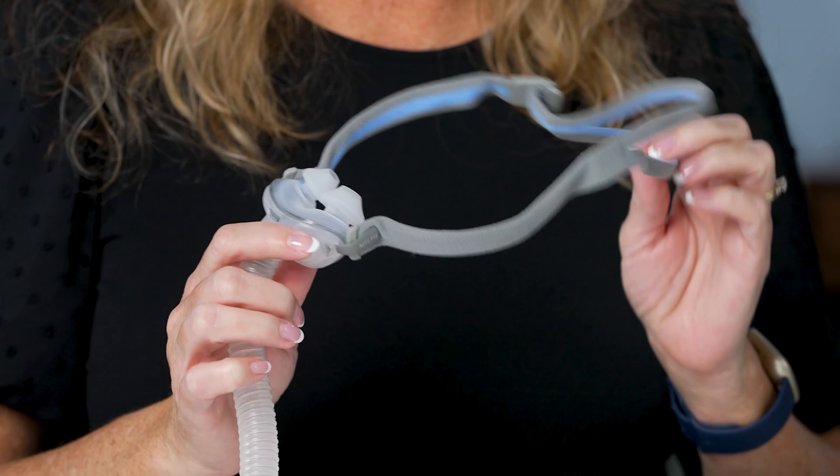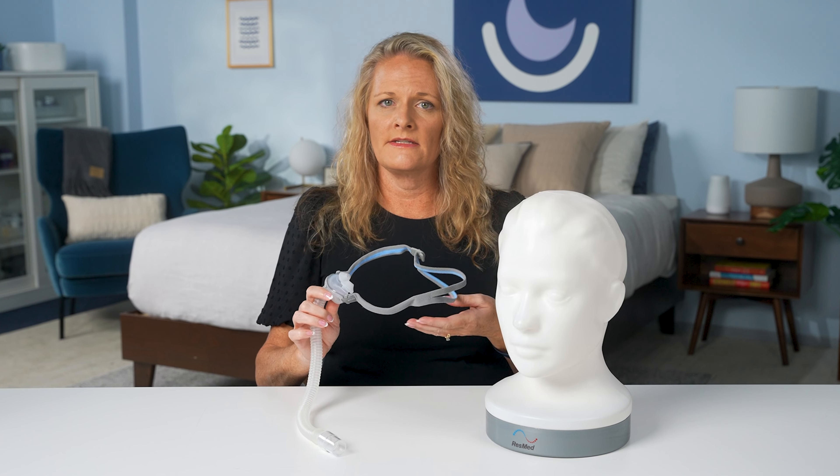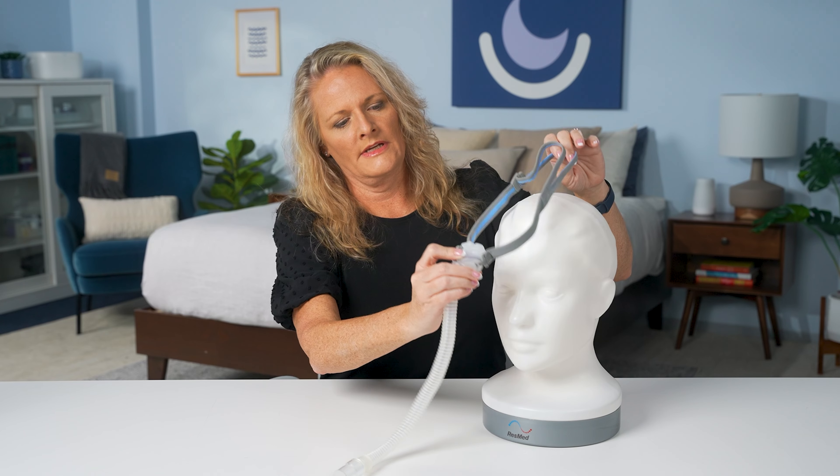First, we have the nasal pillows mask. This mask uses soft silicone pillows or gel pillows that sit at the entrance of the nostrils to create an effective seal. Many of these masks come with fit packs that include various sizes to accommodate the different sizes of nostrils.